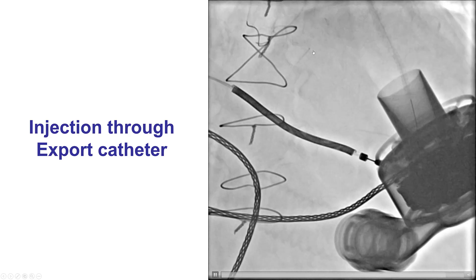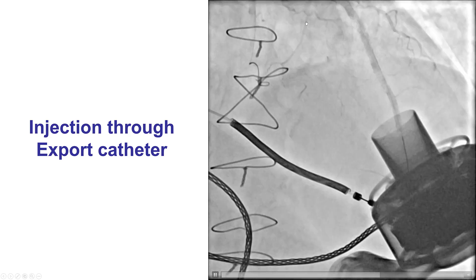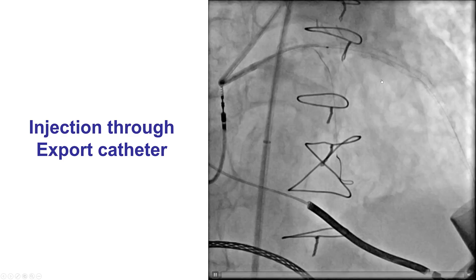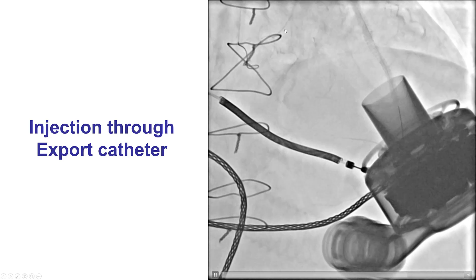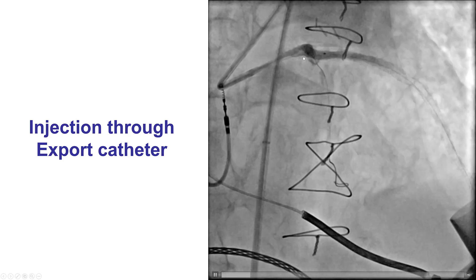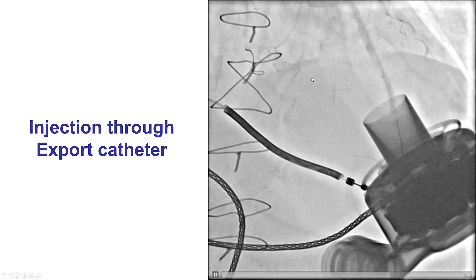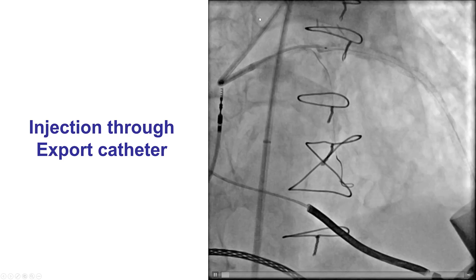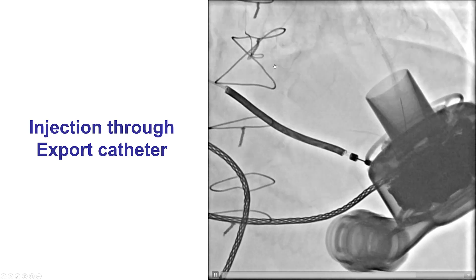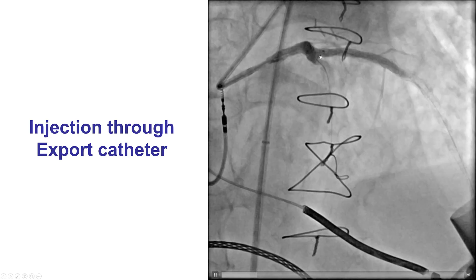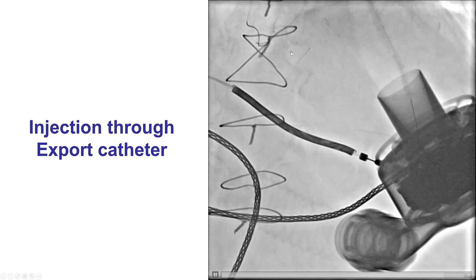We still have some contrast staining within the cusp, which is why we minimized our injections. The LAD looks wonderful, but now we have a new problem — we have lost flow into the circumflex. During attempts to deliver the stents, there was some movement of the wire into the circumflex, and it appears that wire movement likely caused dissection of the circumflex.